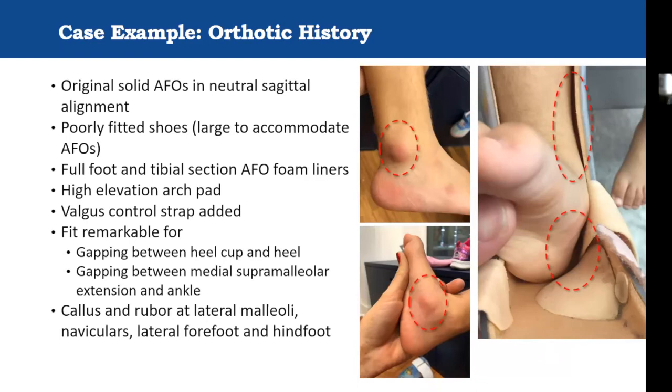There was the addition of a high elevation arch pad, but you might question how effective an arch pad would be without plantar flexors. It has a tendency just to dorsiflex her into the upper of the shoe, because she really has unrestricted dorsiflexion, so trying to use that element to control her hindfoot, you wouldn't expect to be very effective. A valgus control strap was also added, again an attempt to control the hindfoot.